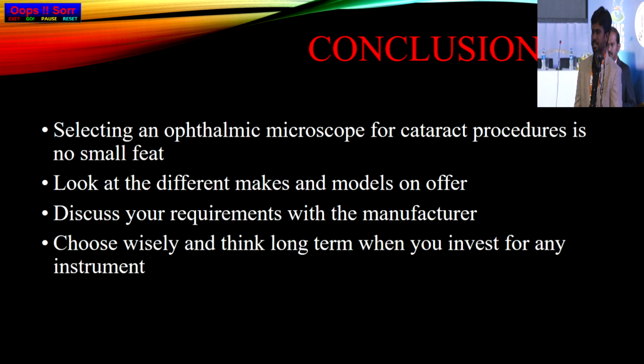I call them once every 6 to 7 months. I have a date when I have cleaned it, so after 6 months or so, I do it. The problem is I fitted OmniGlow, so cleaning the lens is not possible without removing that device. It looks a little fragile, it doesn't look solid, and the weight of the equipment has increased. So I ensure they come, check the screws, tighten them, and then go.